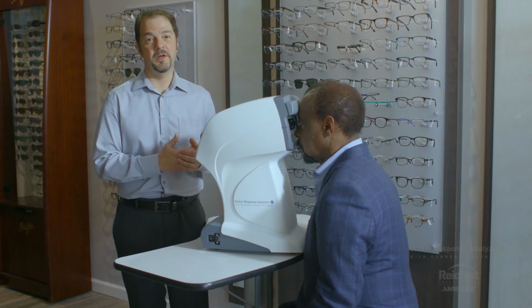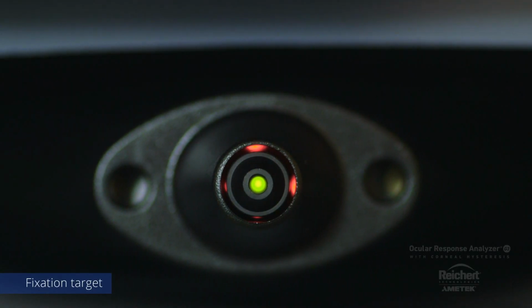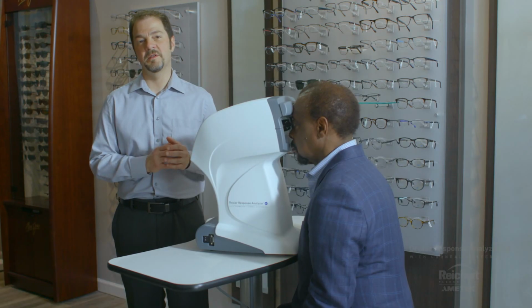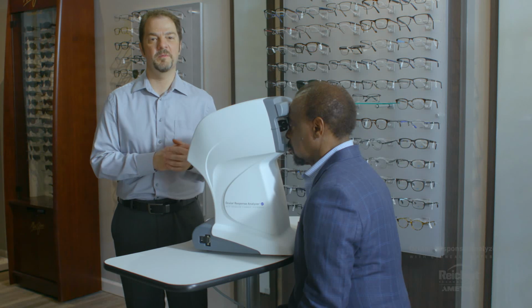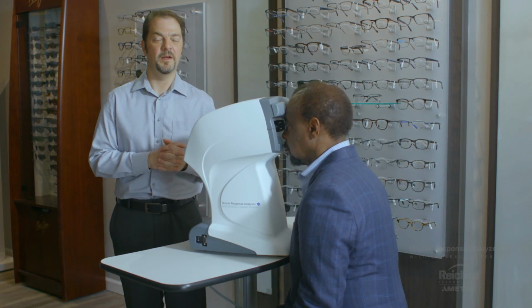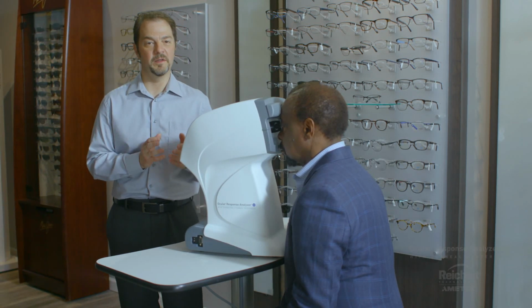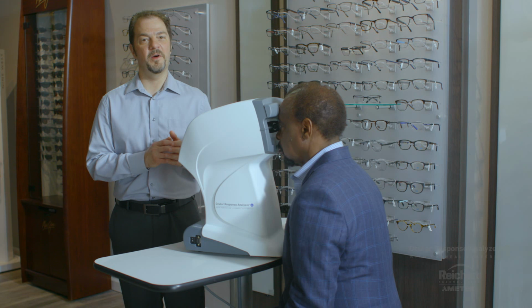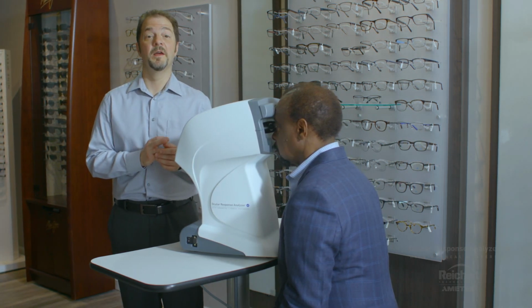The patient's going to be looking at a fixation target, which is a series of red LEDs with a green LED in the center. I don't ask the patient to differentiate between the green and the red LED because when you press the measure button, the only thing that will remain illuminated is the green LED, and that's the primary fixation target. I simply ask the patient if they see any lights, and if they do, they're in the ballpark and the auto alignment system is going to automatically align to the eye and measure.